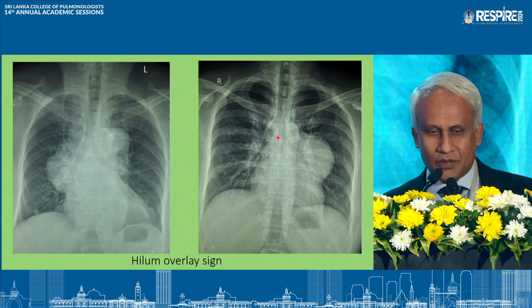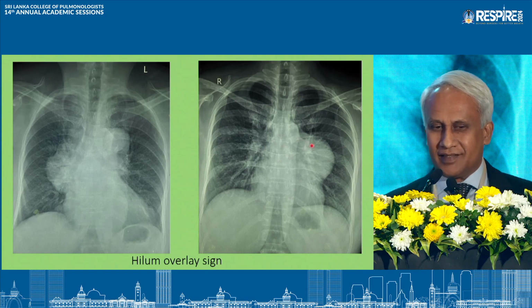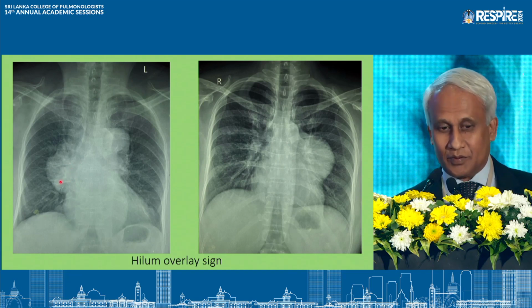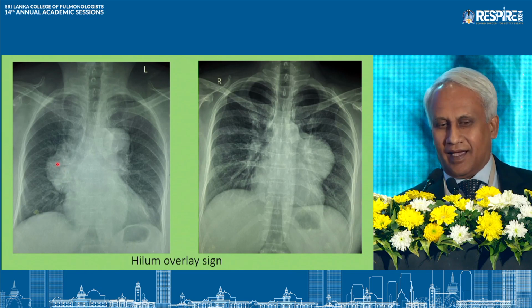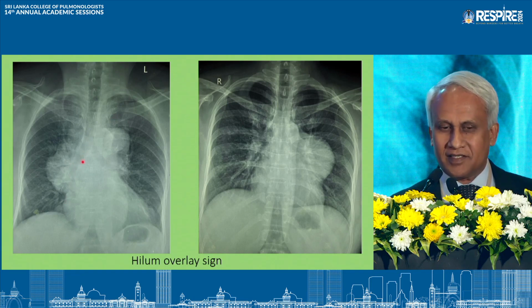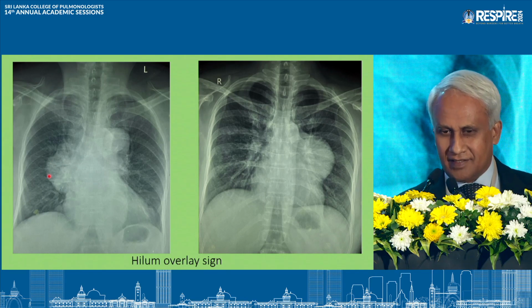And in this one, it is obvious you have bilateral hilar lymphadenopathy. Then you can see 2 masses either side, in the right mid-zone and the left mid-zone. The important thing you can notice here is that through these opacities, you can see the vessels. In this X-ray, you won't be able to see the ascending aorta. So very likely this mass is touching the ascending aorta, and it is in front of the hilar vessels.